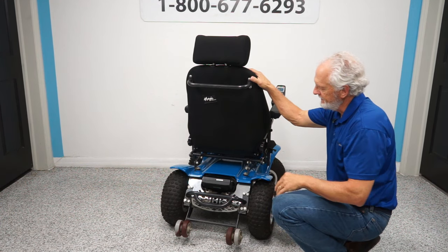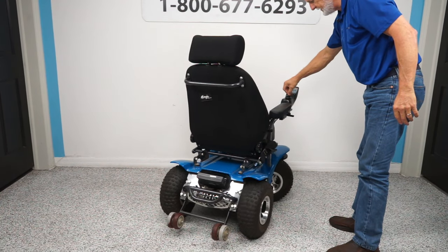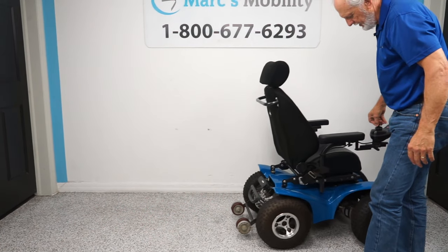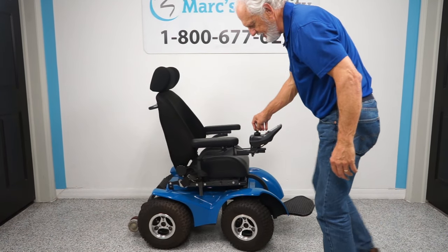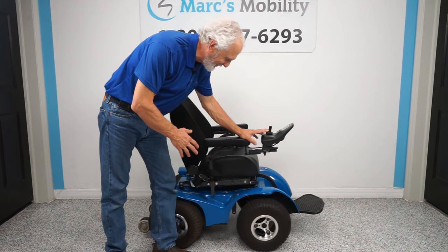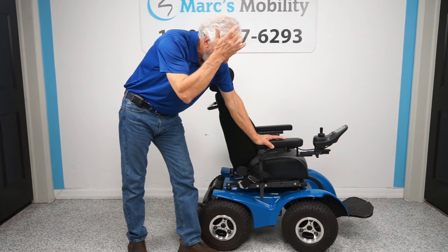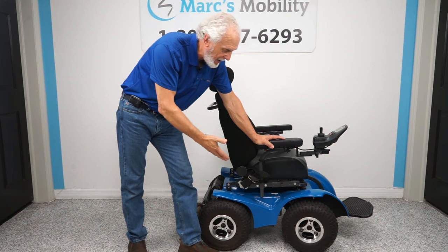This is not an inside chair — you cannot use this chair in your home; you're not going to be able to get around your house with it. This is strictly an outside chair, but you can go on the beach, go four-wheeling, anywhere you want — in the woods, whatever. The power is there.